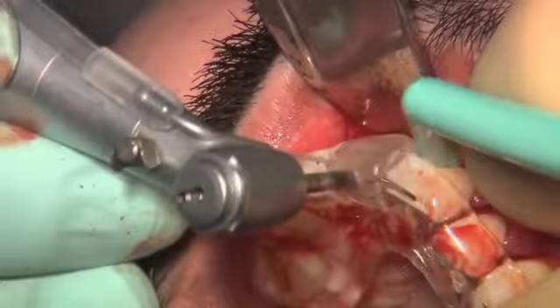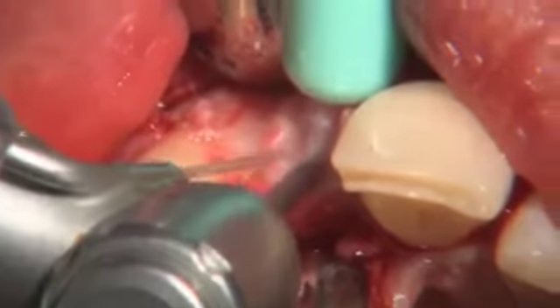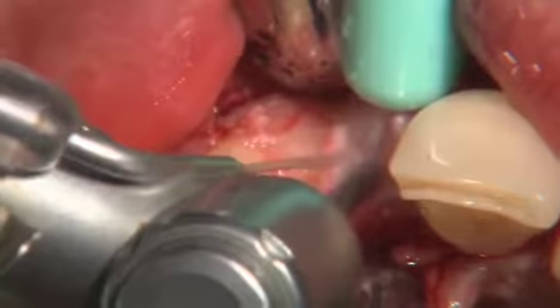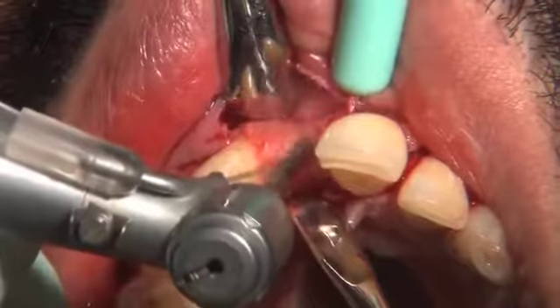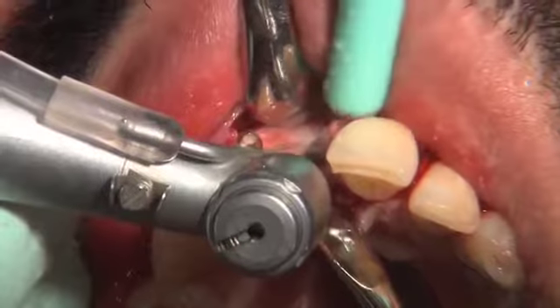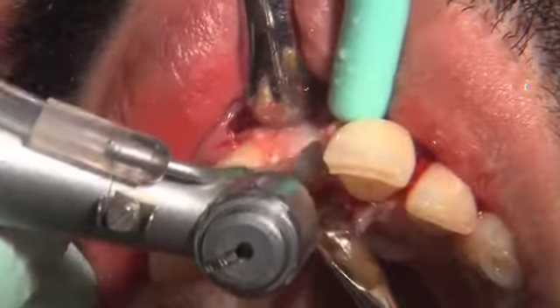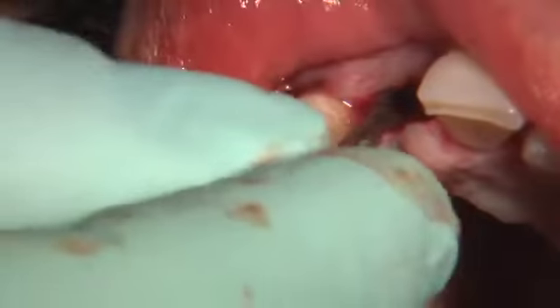The prosthetic stent is then reapproximated and the initial drill is placed. Confirmed once the prosthetic stent is removed, utilizing the pilot drill just to reorient the alignment slightly. And the osteotomy is expanded and developed fully utilizing the subsequent drills. In this case, the decision was made to place a 3.7 by 11.5 millimeter implant.